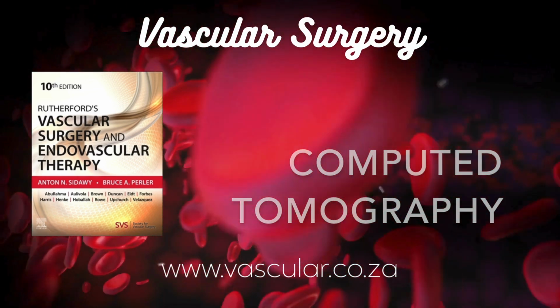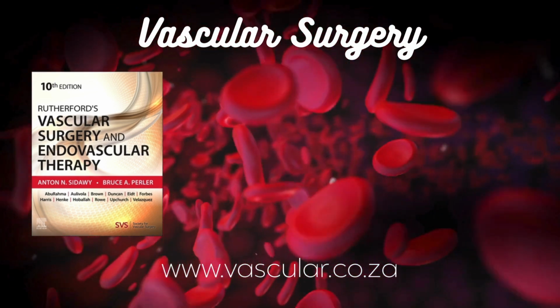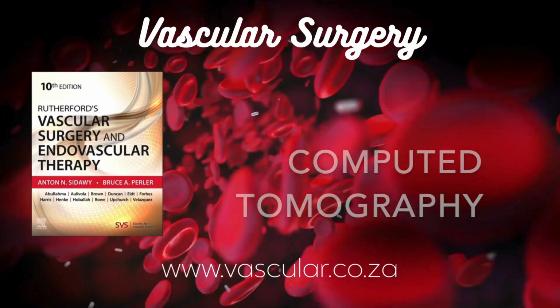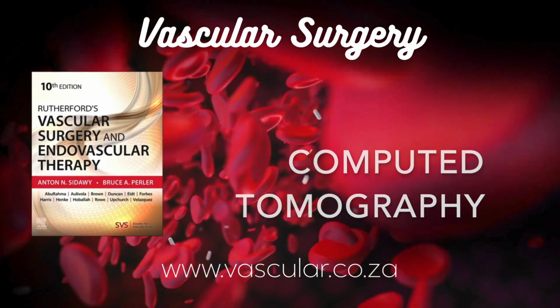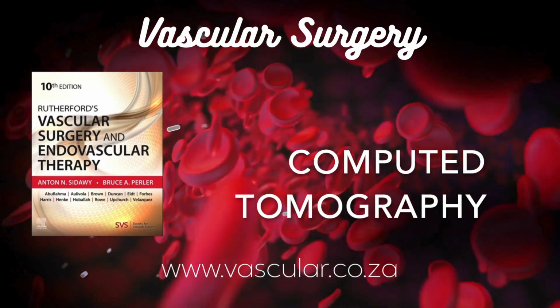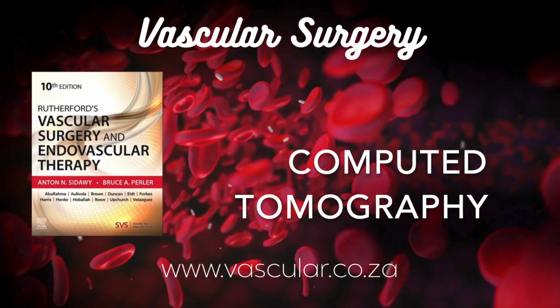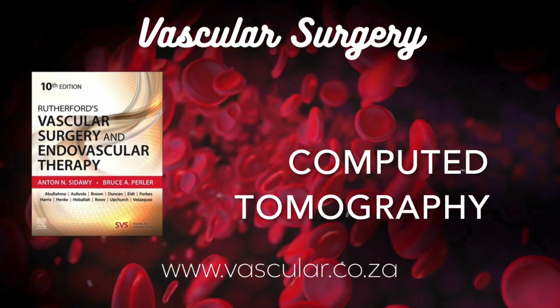Okay, so spiral helical was a big step. What came next? The next massive leap was multi-slice CT, or multi-detector CT, MDCT. Multiple detectors. Exactly. Instead of just a single row of detectors opposite the X-ray tube, these scanners have multiple parallel rows of detectors lined up along the length of the patient, the Z-axis. So they can capture more data with each rotation. A lot more data. In a single rotation, which now happens incredibly fast, like 0.2 or 0.3 seconds. That fast? Oh, yeah.